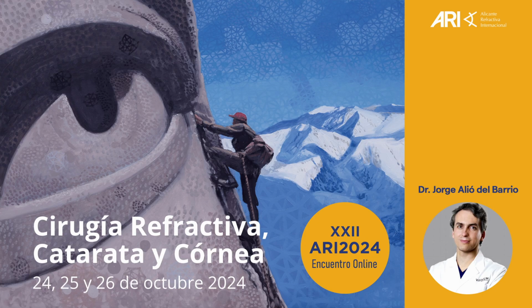It is very important to take into account that not everything that initially looks like keratoconus is actually keratoconus, since we have several devices available that provide OCT technology, epithelial and stromal maps. We have been able to identify many cases that, if we use only the anterior curvature maps, look like keratoconus, but they're actually not. That points out the relevance of having devices that can supply us with epithelial and stromal maps throughout the cases of what we call pseudoectasia.